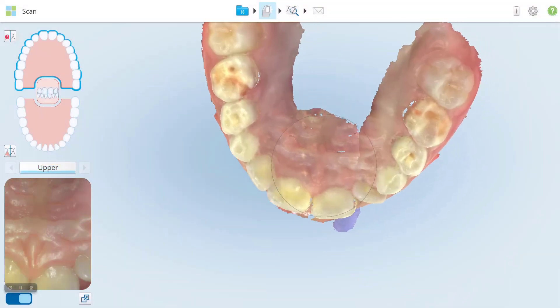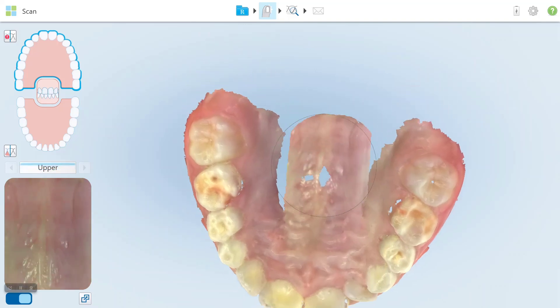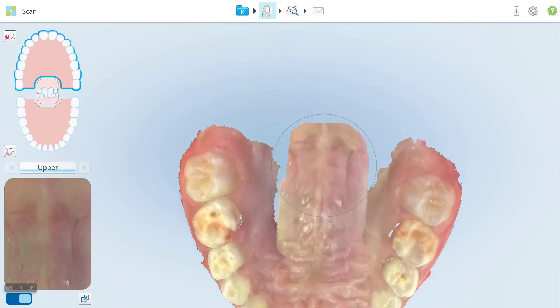Start the palate scanning with a straight line from the incisive papilla to the posterior area of the palate. This line must capture until the distal intermolar line.